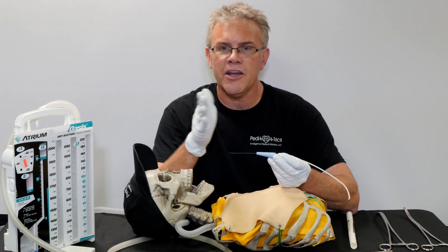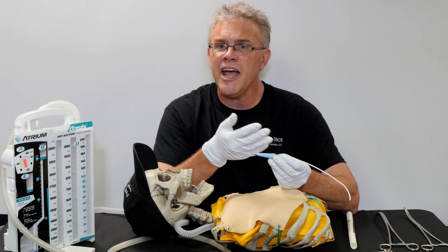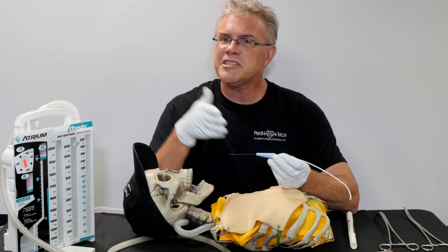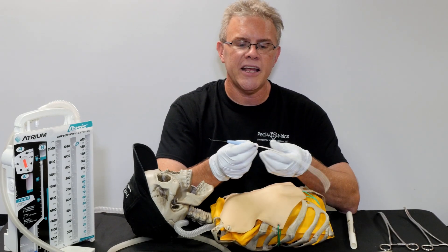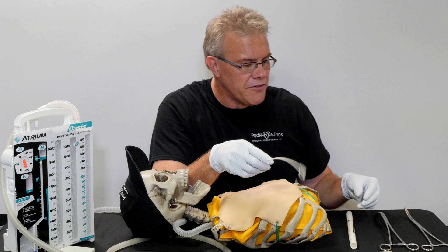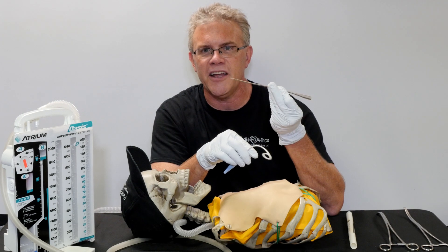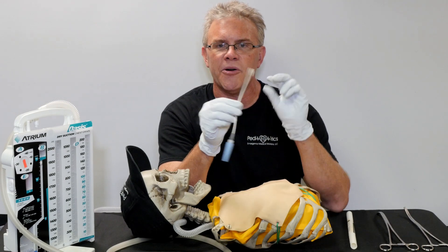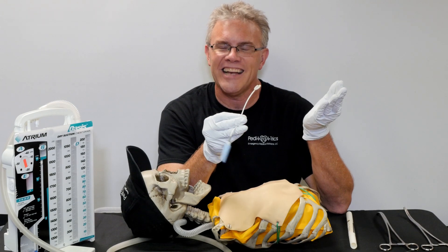Exactly the same idea applies with pigtails — whether it's a baby, a kid, or an adult. You stick, you get air back, meaning you've hit what you're trying to hit. Then instead of making big incisions and using spears or javelins, you just simply thread in the guide wire. Once the guide wire's in, you thread the pigtail catheter over. And if you have a choice between a large, stiff piece of plastic in your chest or a very flexible piece of silicone-like material, which one you'd prefer is not hard to pick.